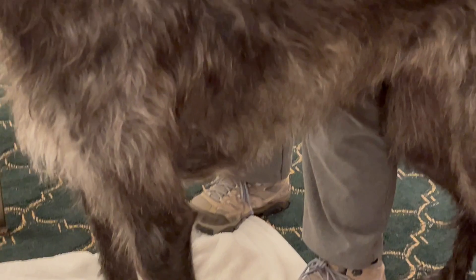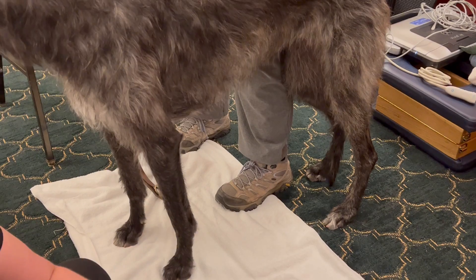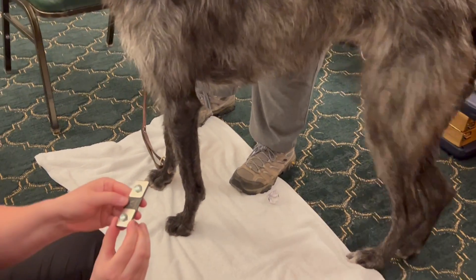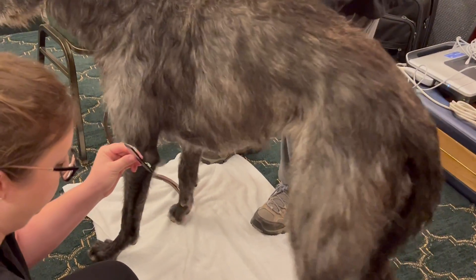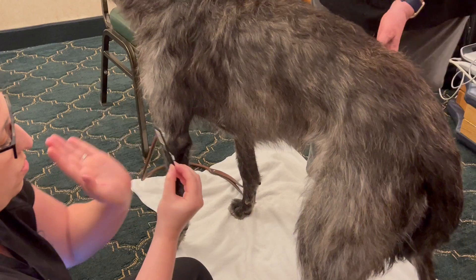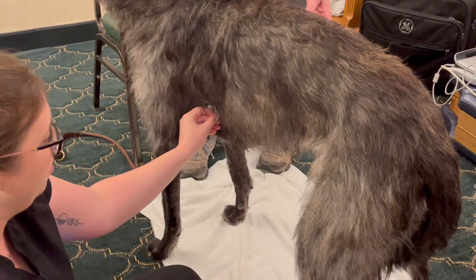That's how we're going to hold it. Alcohol, hand sanitizer, or gel actually works best to get contact, so I'm going to put a little dog gel on each electrode. Again, that arrowhead symbol goes towards the tail. It's easiest if you use your hand to hold the device to the dog for a little more good contact. I'm going to put that over where I feel the heartbeat.